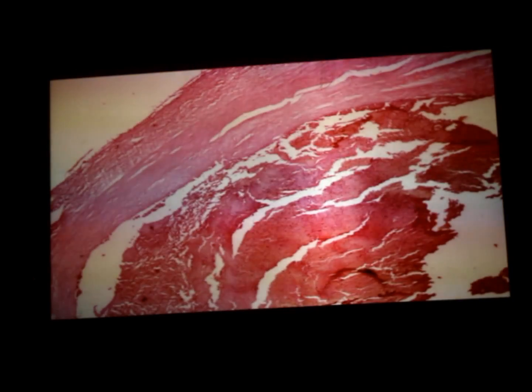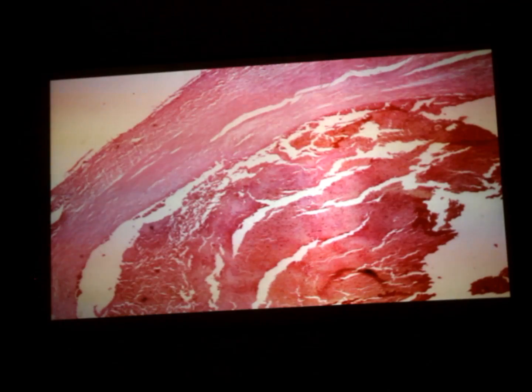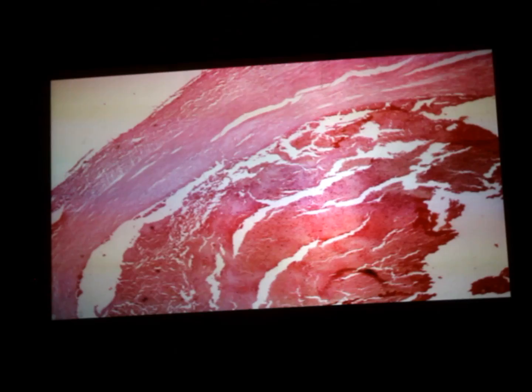Remember this. This is another picture of a thrombus. This is a blood vessel wall. Okay. Inside you can see from here this has started forming and a big thrombus is formed inside the blood vessel. Whenever a thrombus is present, it will cause obstruction to flow of blood. Blood cannot flow, okay, because there is some obstruction inside the blood vessel. It is not open completely. Some part of it is blocked by this thrombus. So obstruction to blood flow occurs because of this thrombus.